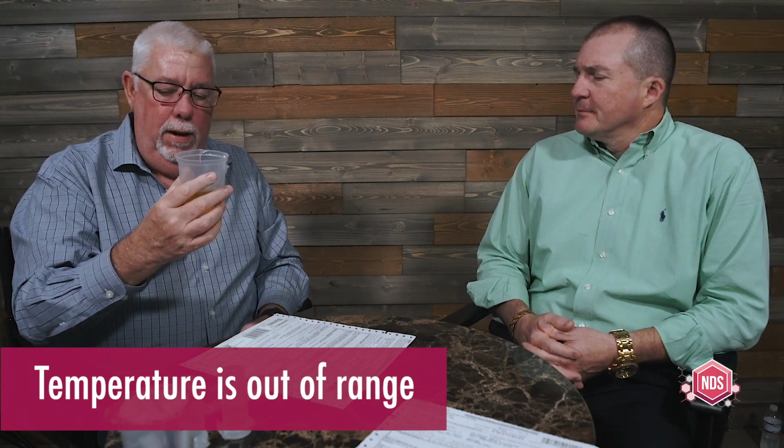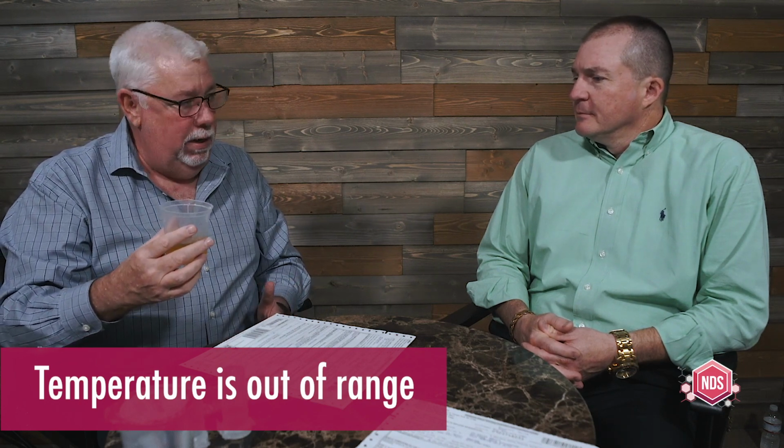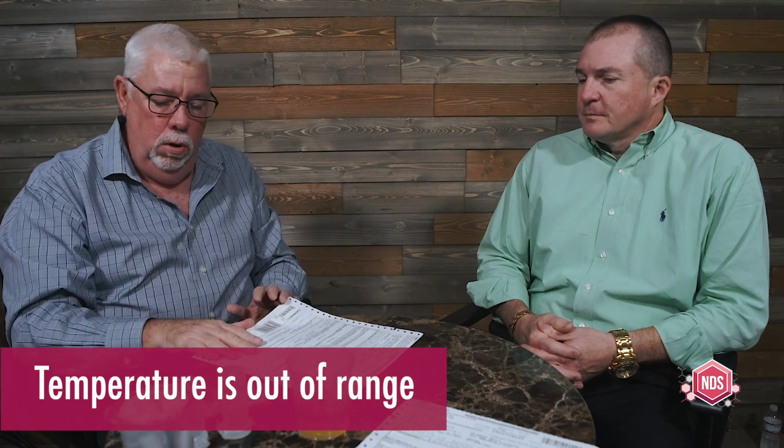Well, unfortunately, there are certain requirements by the DOT federal regulations that we now have to follow when we have this specimen out of range. So what's going to happen is we're going to finish this collection in its entirety, get it sealed up, ready to send to the lab. And then I'm going to ask you to provide another specimen. And the second specimen is going to need to be provided under what we call direct observation.